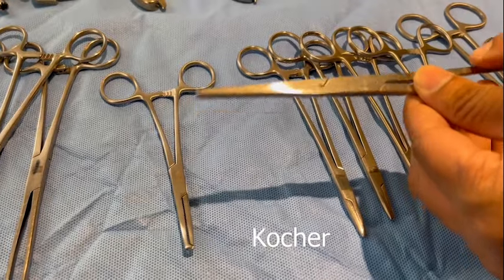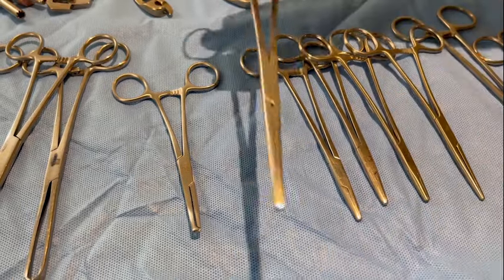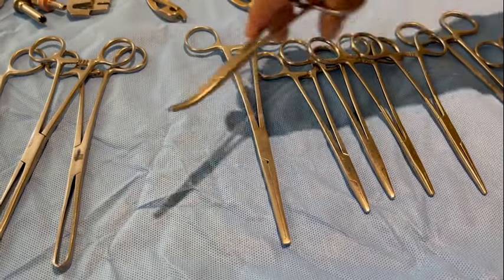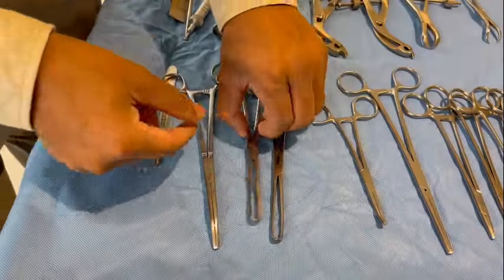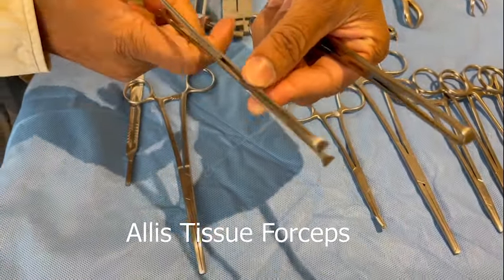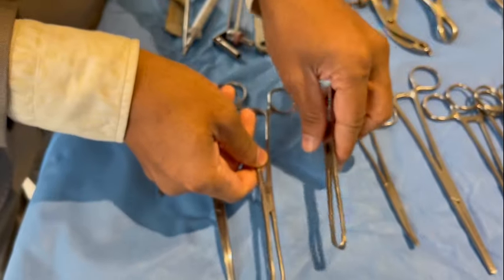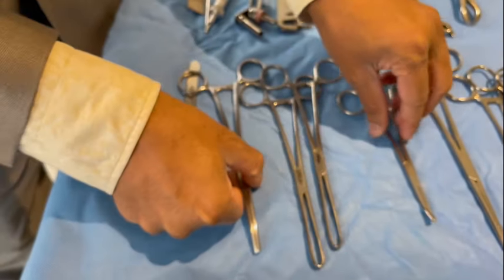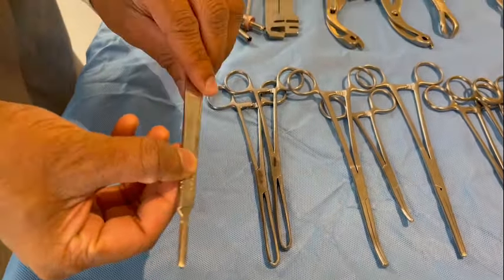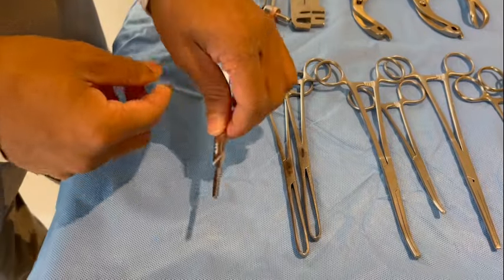This is a Kocher. A Kocher is for holding the tissues very strongly and manipulating them. This is a straight Kocher and this is a curved Kocher. These are the Allis forceps, used to take hold of tissue — usually a fascia or a tendon. It has a serrated head that articulates to hold the tissue strongly. This is again a curved long Kocher and this is a straight Kocher. This is a handle for a knife, in order to fit knives of various shapes and sizes for the surgery.